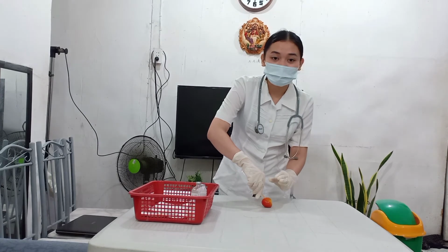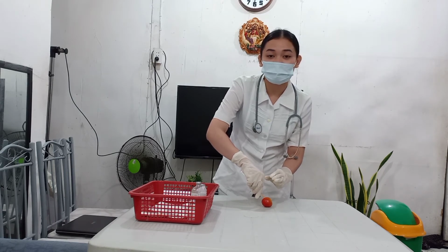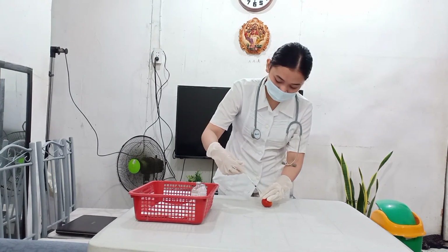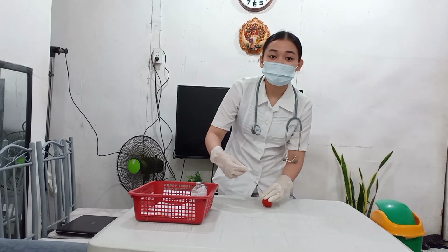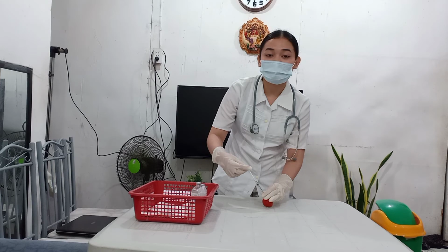And then, we grasp the lower end of the syringe with the non-dominant hand and position the dominant hand at the end of the plunger. We do not move the syringe. This is to prevent movement of the syringe. Okay? Next is to pull back on the plunger to ascertain that the needle is not in a vein. This is to prevent the patient from having hemolysis, or rupture of the cells, or collapse of the vein when pulling back on the plunger.